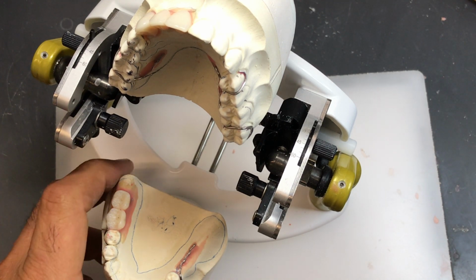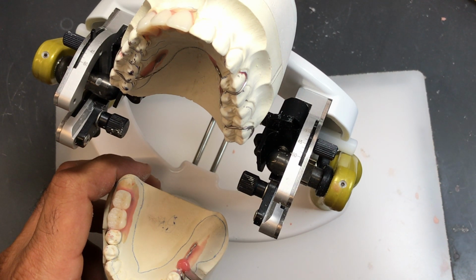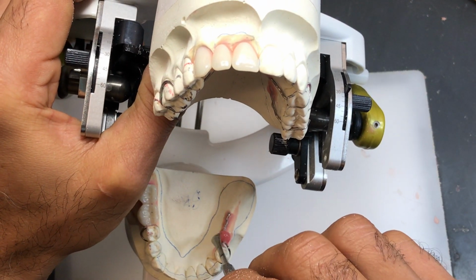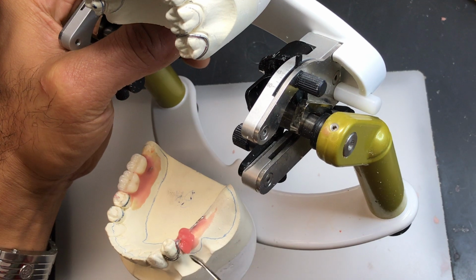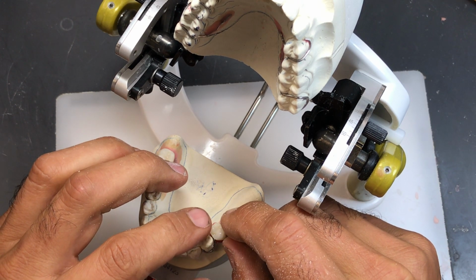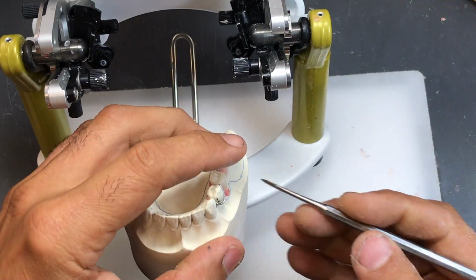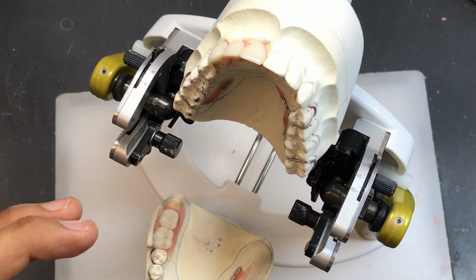Okay, I think I'm close, but just to verify, put a little bit of wax again. Seal it down first so it adheres to the model. A little bit more on top. And then place my tooth in an ideal position to where I think it's going to be. Make sure you get the buccal slope angle, which means I've got to come out a little bit. Got to add a little more wax on it.